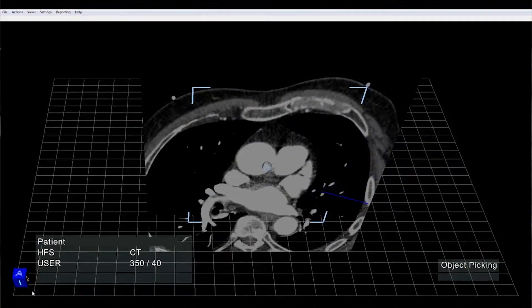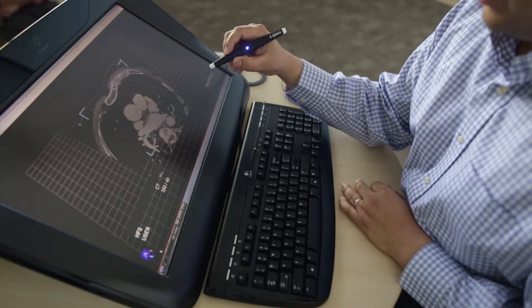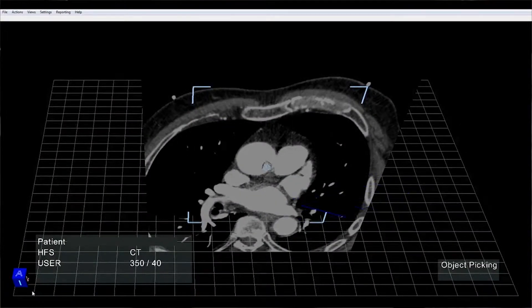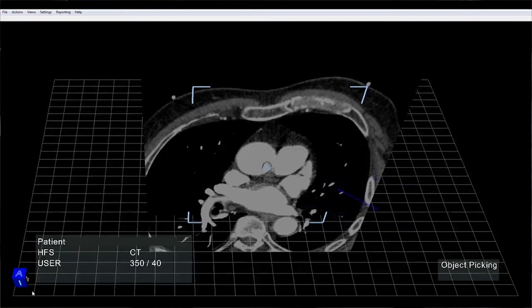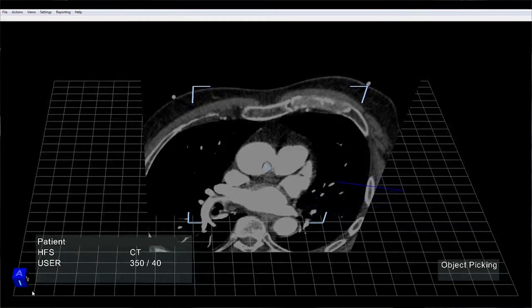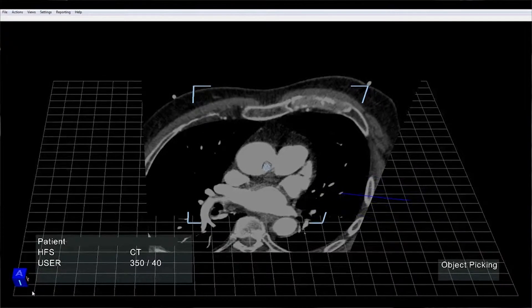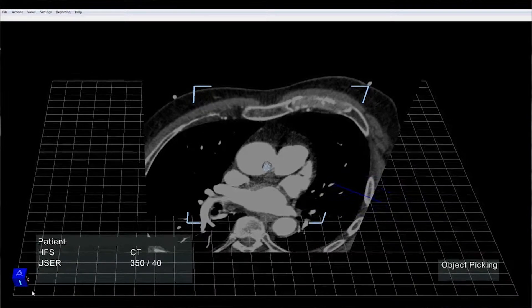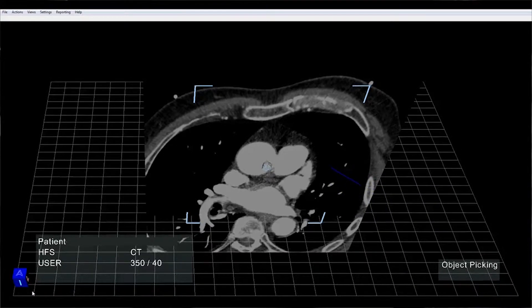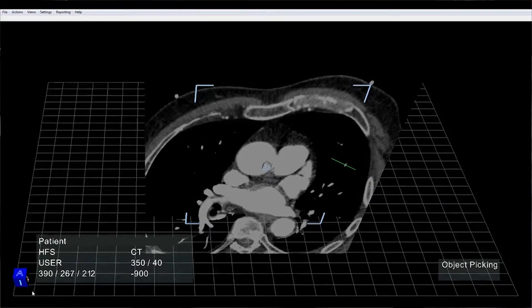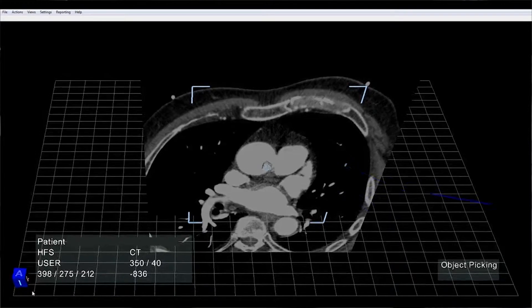As you move the stylus, the blue ray coming out of the stylus moves along with it, and you want to use the front tip of that ray as your selection point. When the ray is not touching anything, it's blue. When the front tip touches something, it'll go green, and that's when you can press and hold the front button to interact with objects.